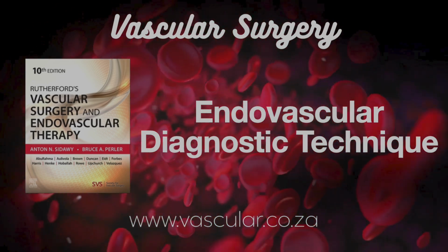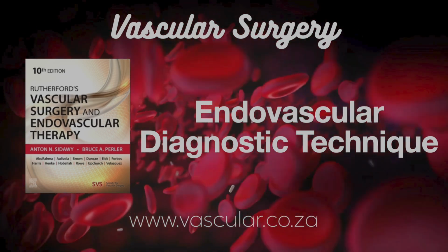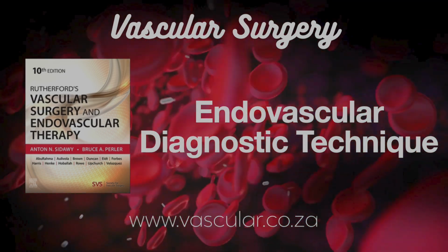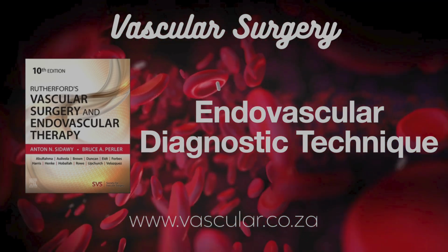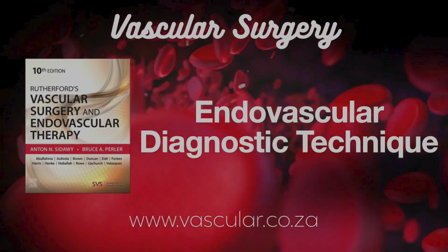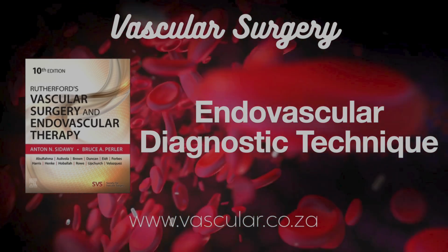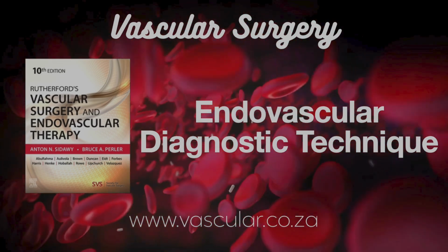Then what? After the main run, pull the catheter back to the bifurcation, where the aorta splits, to see the distal iliacs and common femoral arteries better. Can you get angled views? Yes, oblique views are important for separating the iliac arteries. LAO, left anterior oblique, shows the right iliac best. RAO, right anterior oblique, for the left iliac.